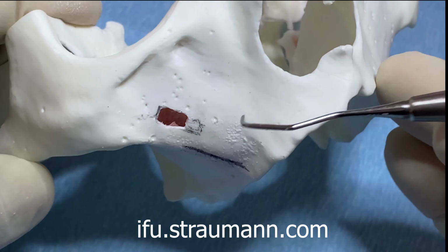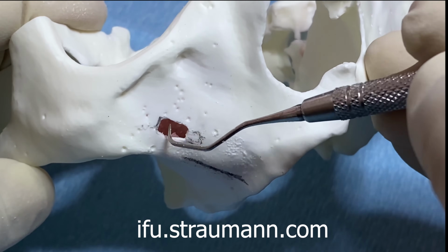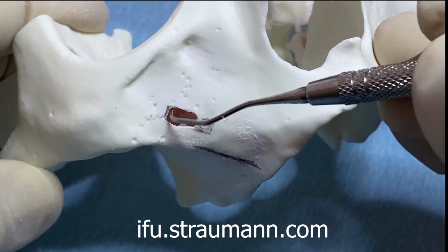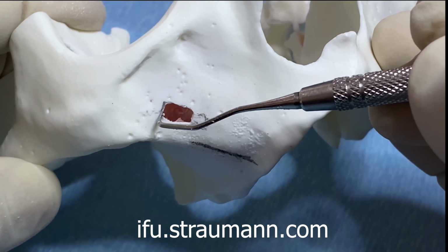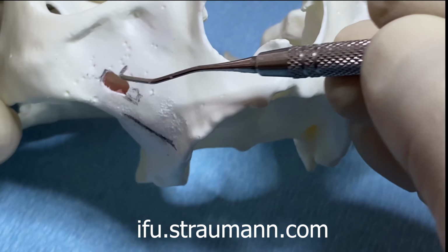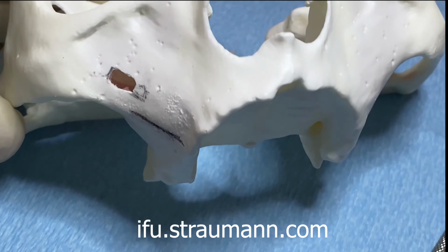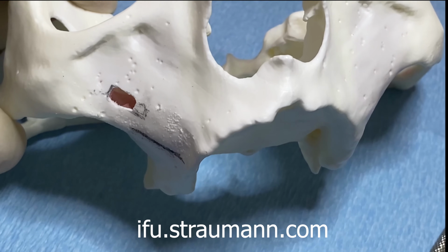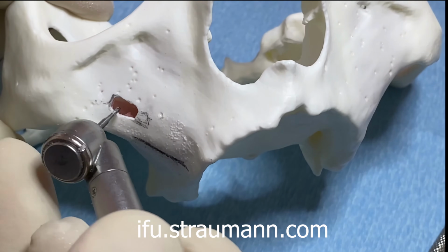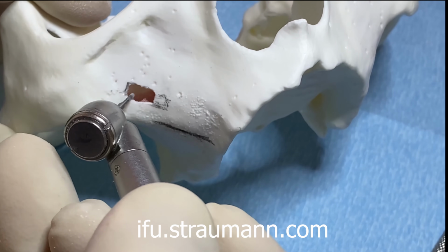There's a limit on how much we can bend our head. So I have a curved instrument usually, and I try to see if I can feel the roof of the sinus. As I'm feeling, the roof is up here somewhere. So I can extend my window a little bit and make it larger in order to be able to see the sinus. So if I keep my orientation the way it is and maybe go ahead and make my window a little bigger, again, paralleling the black dotted line.